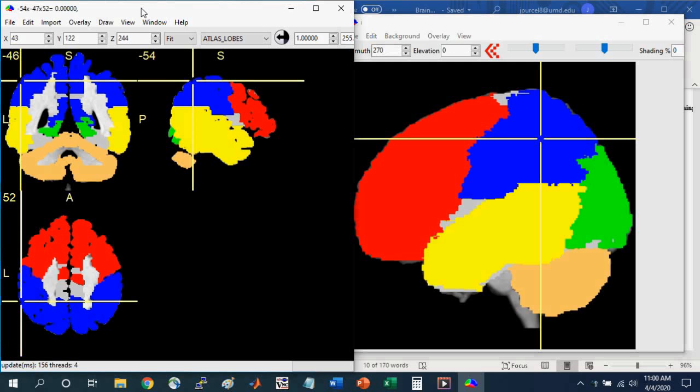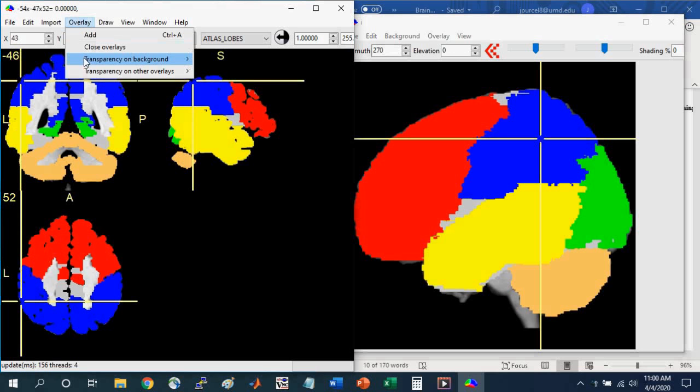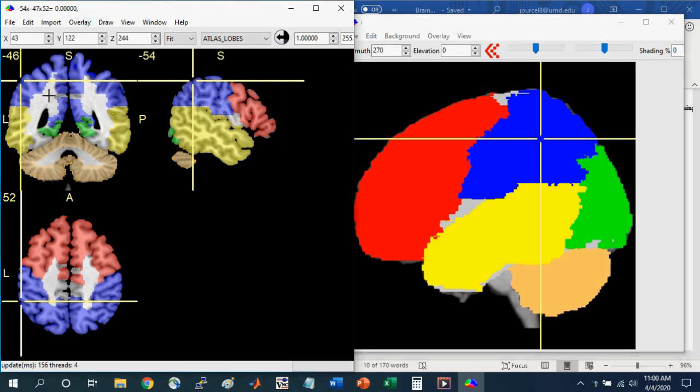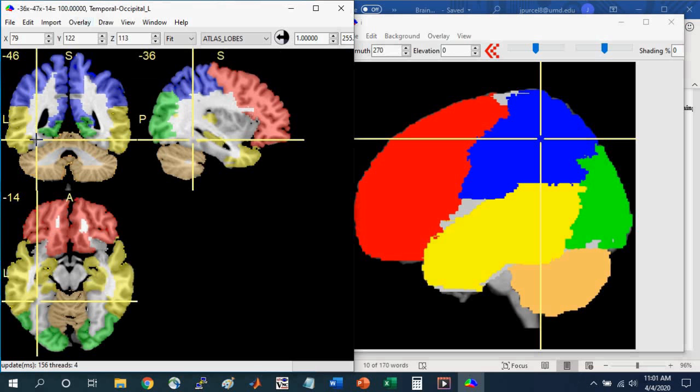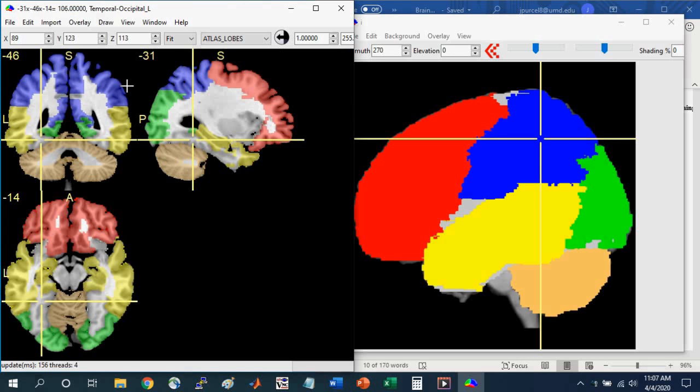Another thing you can do in the slice view window is change the transparency on these overlays. So you can go to Overlay, Transparency on Background, and let's say we'll change it to 60%. And so now you can still see the colors here in the left temporal lobe. But you can see the underlying structures such as the sulci and gyri. As somewhat of a side note, you might notice that some of the regions are grayed out. For instance, this part of the cortex. It's grayed out because it spans both the occipital and the temporal lobe. And so any region that's gray is not cleanly divided into any particular lobe. So this atlas provides a nice introduction to the lobes and the cerebellum.